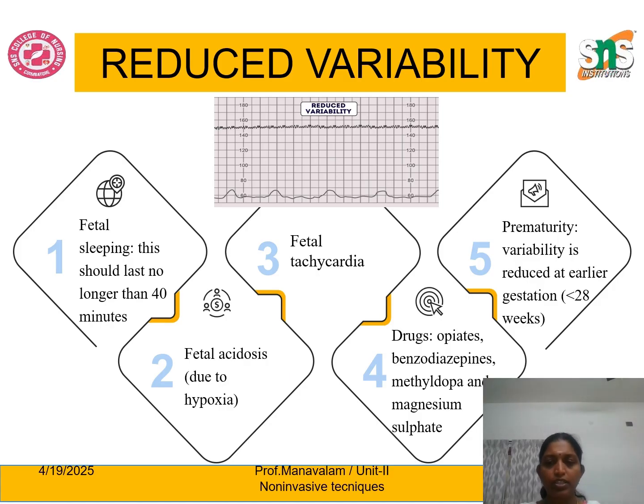Whenever the fetus is sleeping and we put the mother under cardiotocography, we will not get the proper variability. So we have to wait for the fetus to wake up and then monitor the fetal heart rate. Otherwise we have to use different types of stimuli, such as tactile stimuli, or we have to initiate the contraction, whatever it may be. We have to apply those measures in order to wake the baby up and monitor the fetal heart rate if needed in an emergency situation.